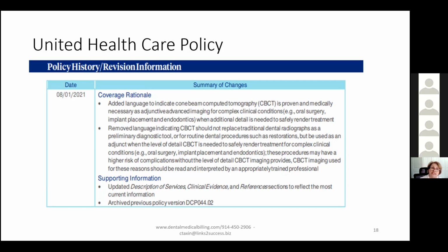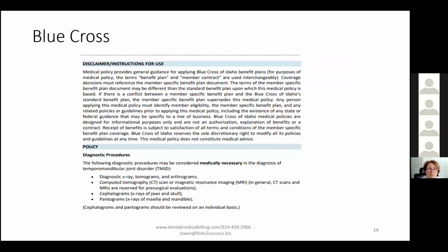So they're actually saying to you, in different language than Medicare, you must be credentialed and you should be using a professional to read the scans. And what happens if we do it and they ask us then for a copy of the scan result? They're never going to ask us for the scan like dental asks us for x-rays. No, they want the written report. So they will, somewhere along the line, come back.